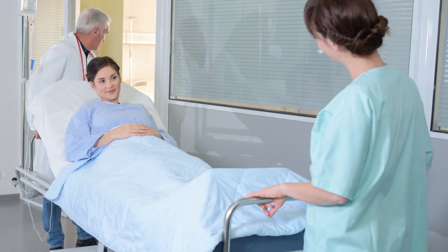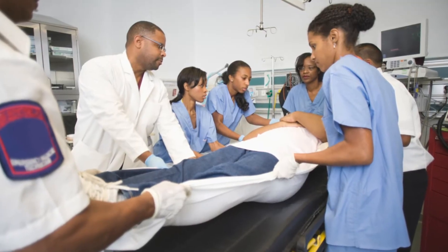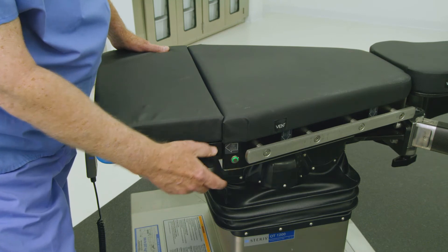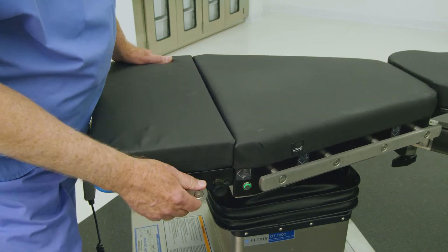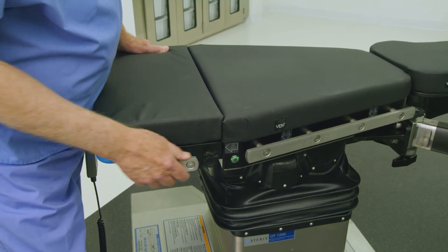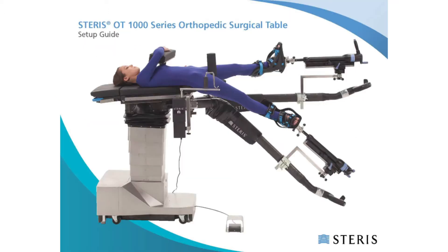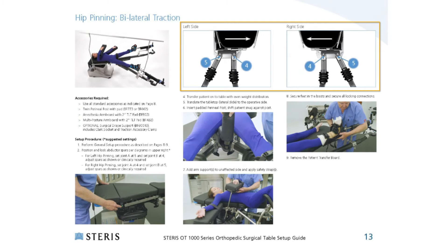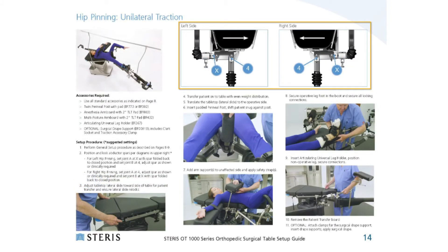Execute patient transfer using facility protocols for safe patient handling and ensure even patient weight distribution. Once the patient is positioned safely on the tabletop surface, adjust the tabletop by repeating the instructions to obtain the desired lateral tabletop position. The centered position is typical for anterior hip cases. Refer to pages 8 to 21 of the OT Table Setup Guide to verify the appropriate tabletop slide position shown in the illustration.